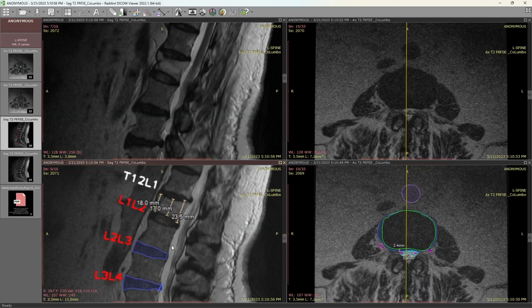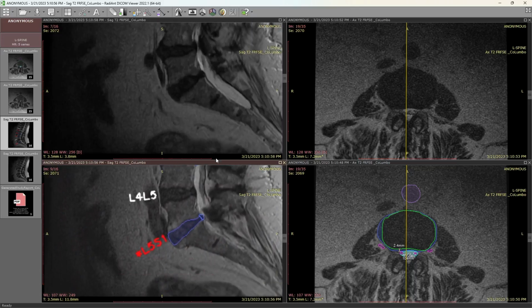In case of a reduced vertebral body or disc height, we visualize the anterior, middle, and posterior height size measurements of the segmented vertebral body or disc. We also visualize transitional vertebrae, but it is not reported.